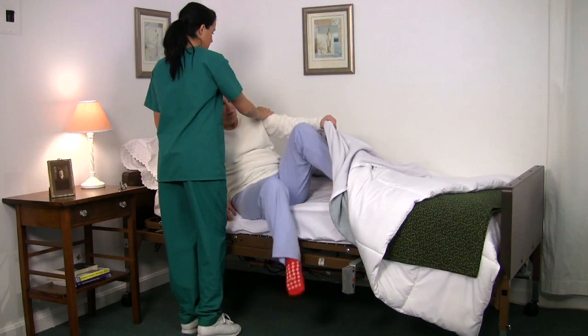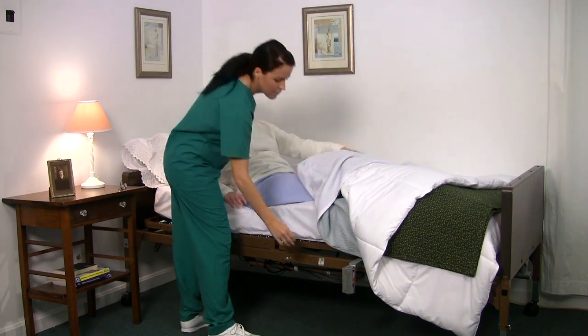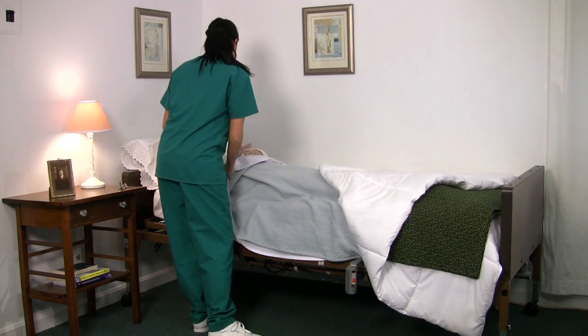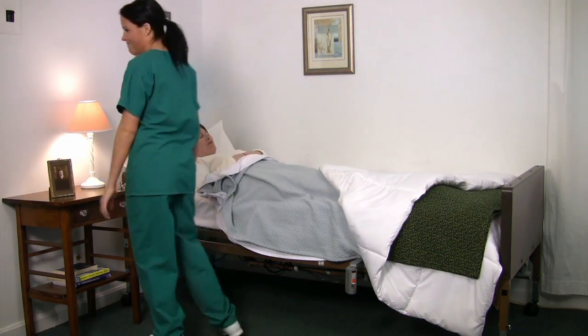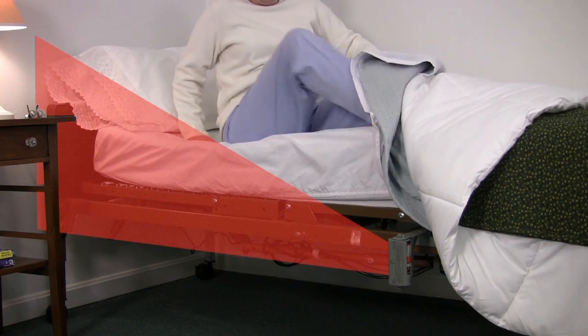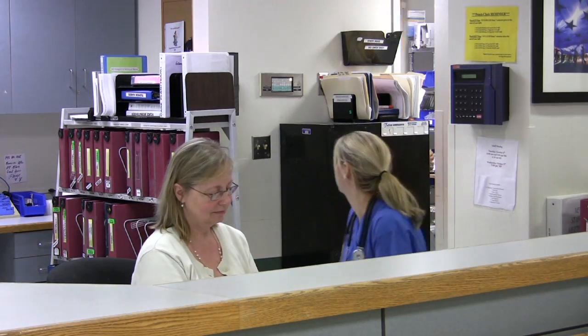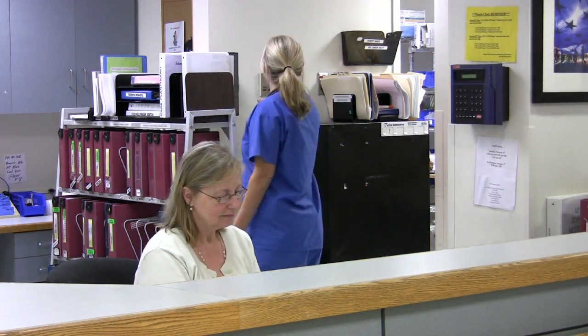Now that both your PIR alarm and nurse call units are set up and functional, you are ready to begin using the PIR system. With the unit mounted in the specified area and the patient in place, turn the device on. Remember, you have 10 seconds before the alarm activates in case you need to cross the sensing field. When your patient rises and breaks the beam's path, the alarm will sound immediately both at bedside and at the nurse's station. This gives the caregiver ample time — whether nearby or at the nurse's station — to attend to the patient who is now in danger of falling. Be sure to test the system daily to ensure proper function.